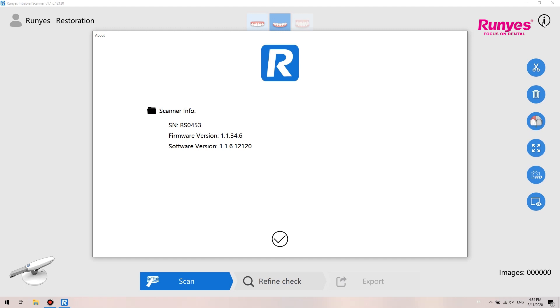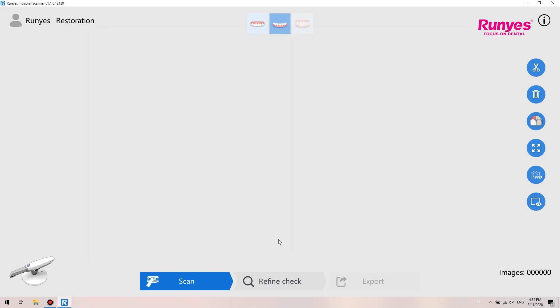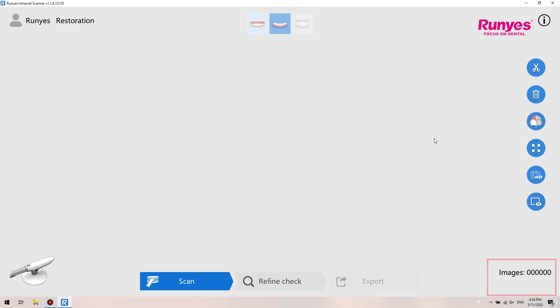Clicking the exclamation point will display the hardware information of the scanner. The right side is the functional area. The scanner icon shows the current scanner status. If an exclamation mark shows up, it means that the software does not detect the scanner — please check whether the scanner is connected properly. This area shows the current imaging acquisition number and scanning time.